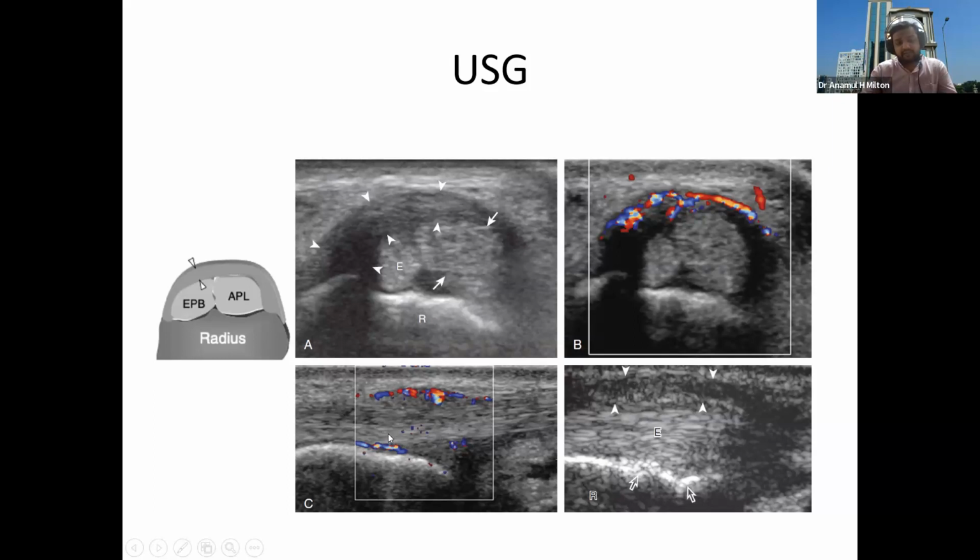If there is any inflammatory disease like rheumatoid arthritis, and the wrist is a common site for rheumatoid arthritis pain, so if there is any pain, swelling, redness, at that time also consider any rheumatological disease. In the third picture, you can see only the sheath is thickened.